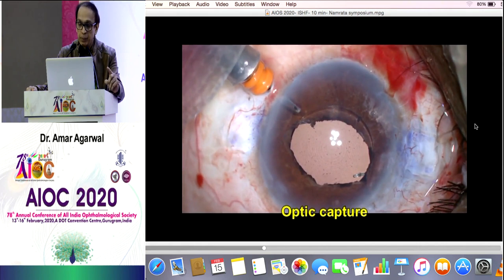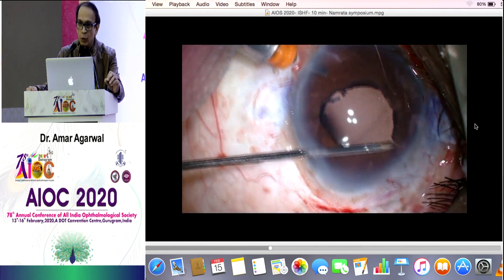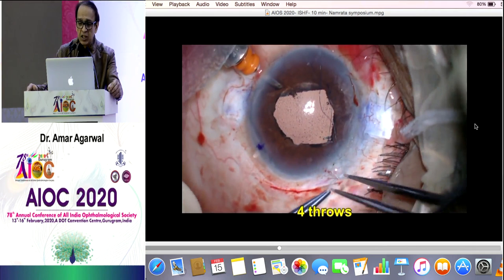But the problem is when you come anteriorly, you can get an optic capture. As you can see there. In case, nothing. Just do a single pass, four-throw pupilloplasty, and I'm going to solve my optic capture on the spot, on table. Another big advantage when I do this is, the patient will never have any positive dysphotopsia. Remember, if you have a patient with positive dysphotopsias or something like that, you can do a pinhole pupilloplasty and your patient will have distance and near without glasses.